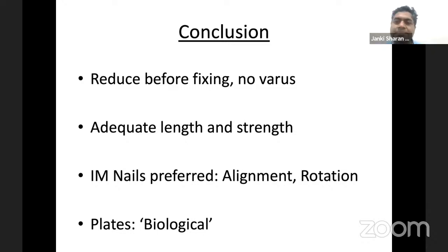Yes, sir, it's clear. One more thing, sir: what problem we face while making the entry hole, especially in the subtrochanteric fracture. How to make it easier, because of the displacement, or even if we are doing closed reduction, the entry point is not as accurate as in other fractures like intertrochanteric. Yes. Generally, the recon nails have a trochanteric entry point, not the piriformis entry point.